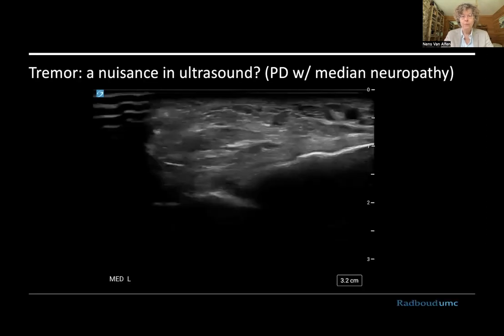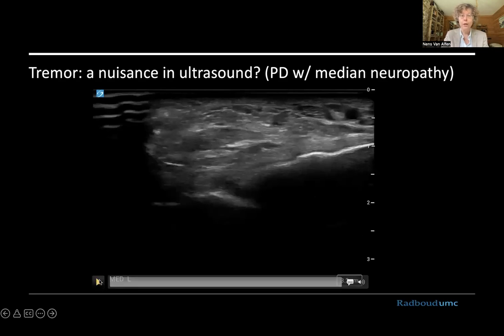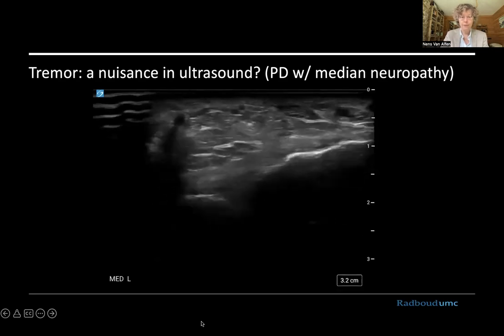So, tremor. It's not a common topic to be talking about in muscle ultrasound. We don't regularly use it yet. And when we see it, it's usually a nuisance. So just look at this video here.